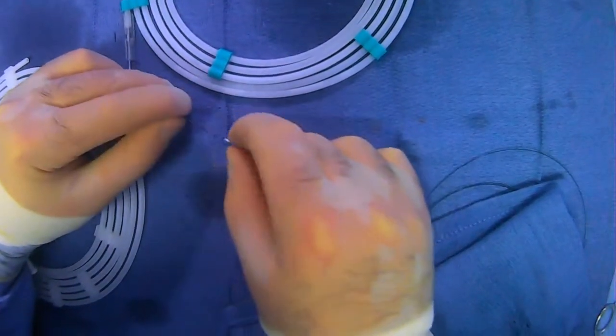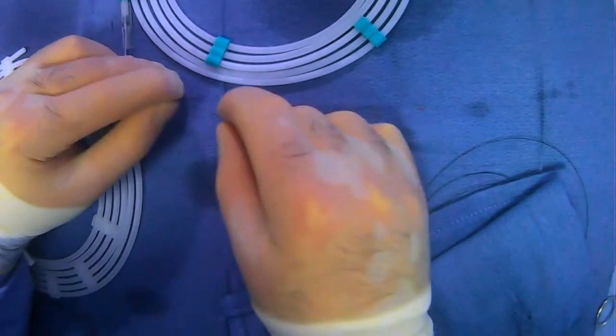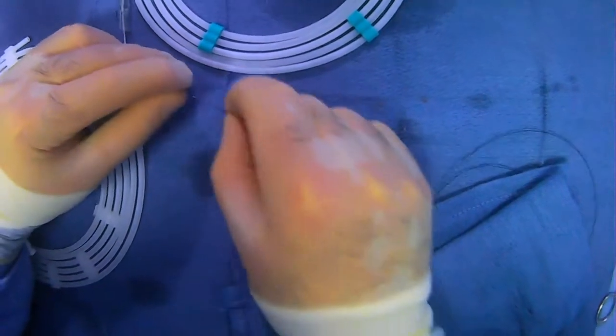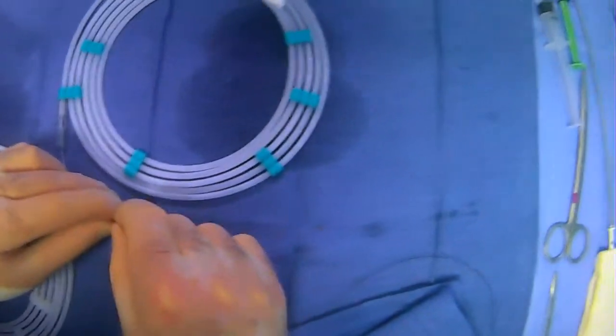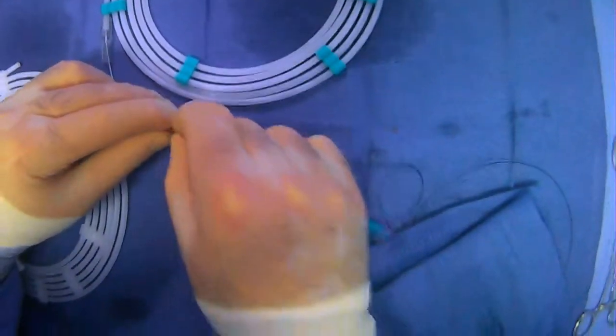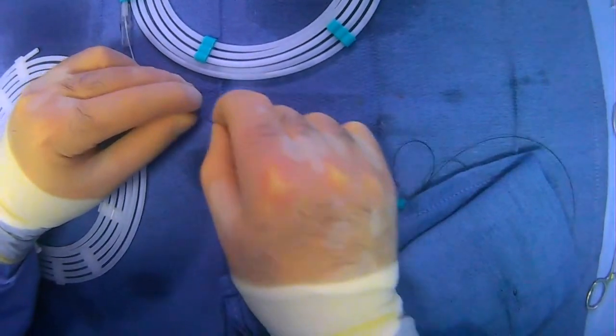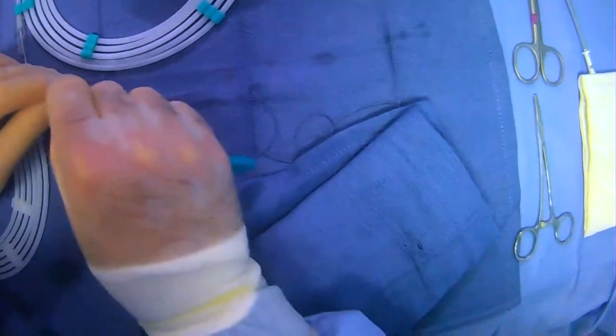So we'll just load this all in here as much as we can and prepare our microcatheter here.